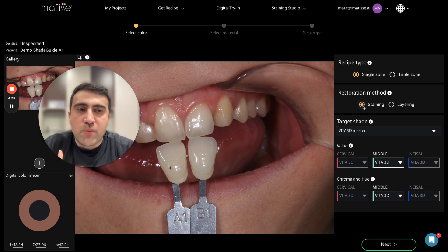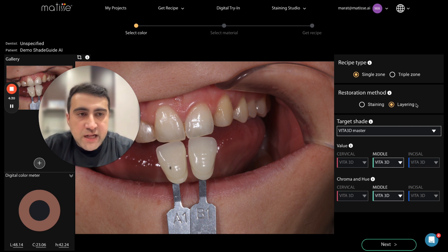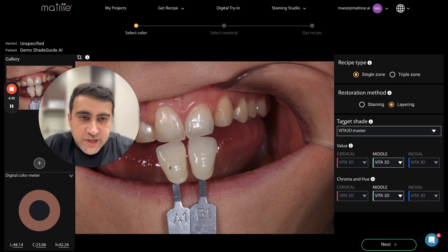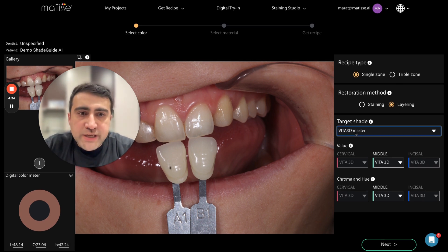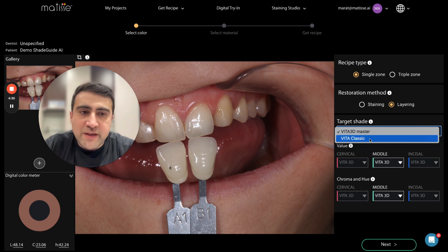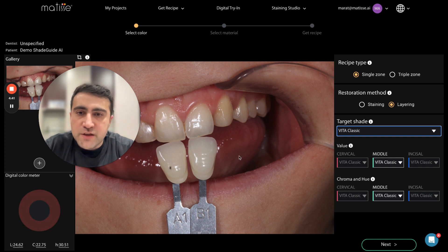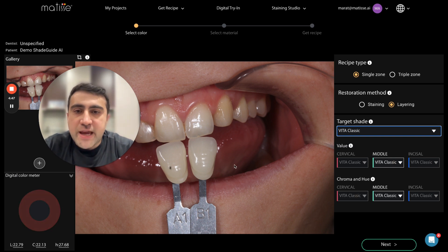Restoration method: do you want to use staining techniques or layering techniques — a staining recipe or layering recipe? Staining recipe can be applied for monolithic crowns, and layering speaks for itself. Target shade: we are using two shade guides at the moment — Vita Classic and Vita 3D Master — and you select the shade guide which is used during shade taking.